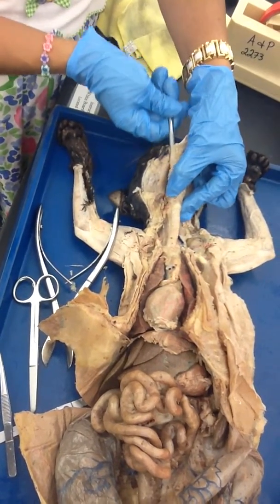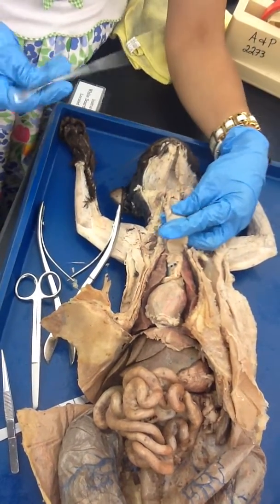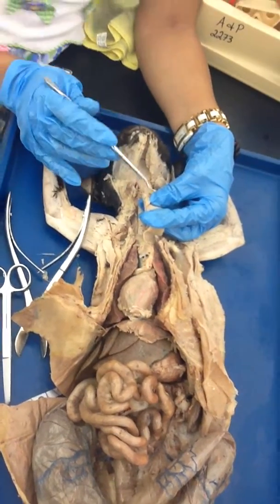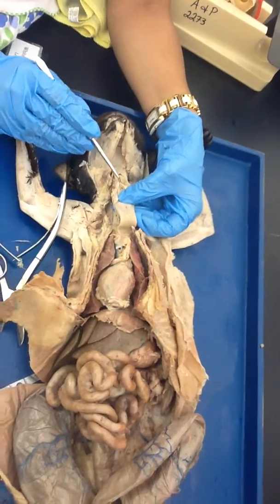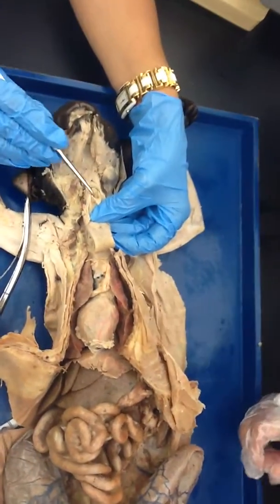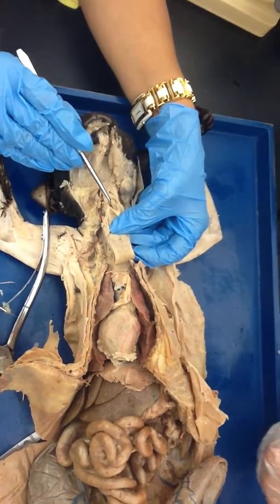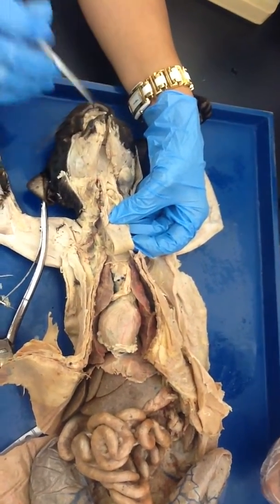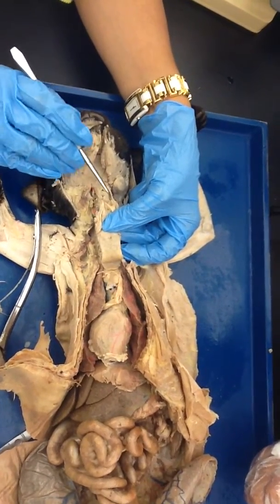When you feel the probe inside the trachea, that means you are in the laryngopharynx right here. You can see the probe — this is your laryngopharynx. So where is the larynx? Right here — this is the larynx. And do you see these? These are the vocal cords. And this area is the glottis.